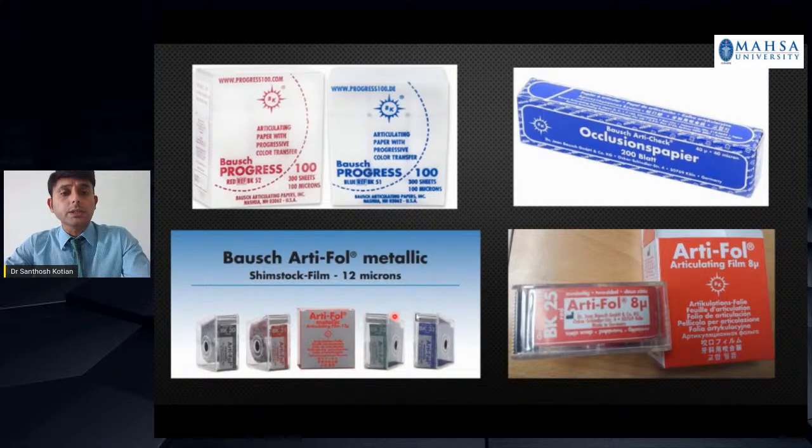The much thinner versions are the 8 to 12 microns, which is a shim stock film actually. These are metal foils. Usually they are not colored. This is basically used to check for the presence of tight occlusal contacts. I can also check for proximal contacts using them.